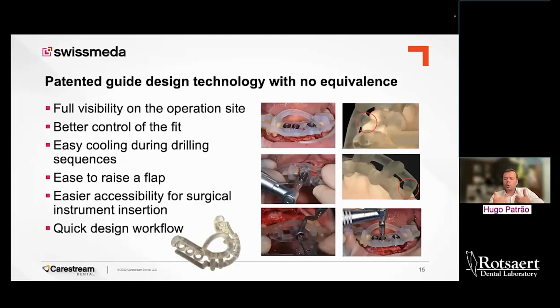The only way that you can cool a surgery site is through saline, water, and air. So if you shell the surgery site, the osteotomy site, with a bit of plastic like a mouth guard, you don't get any water or any air to ventilate it, and the chances of necrosis increase with time. As I mentioned, it is also easy to raise a flap. There is a misconception that guided surgery is a flapless technology or a limitation of the surgery, and it's not the case. Any guide that limits your surgery is, in fact, not a good guide.